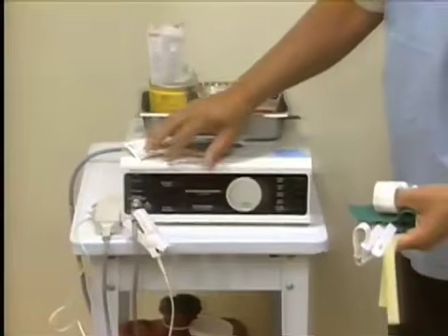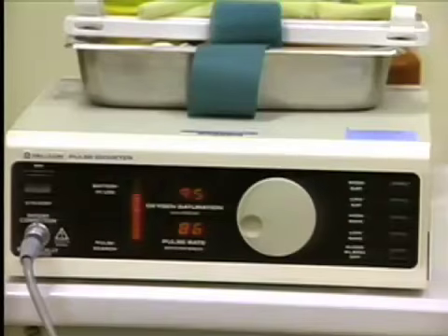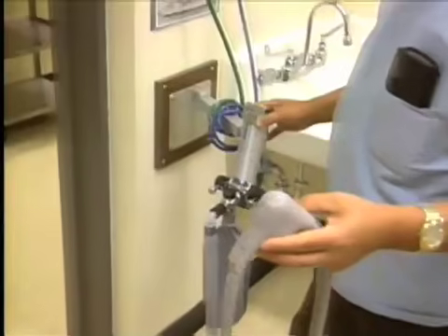Whenever conscious sedation is utilized in the clinic, a pulse oximeter is absolutely necessary to monitor the oxygen saturation of the patient throughout the entire procedure. Another anxiety service that we have for the patients is that of an analgesia machine. Demonstrated here is a wall-mounted unit.